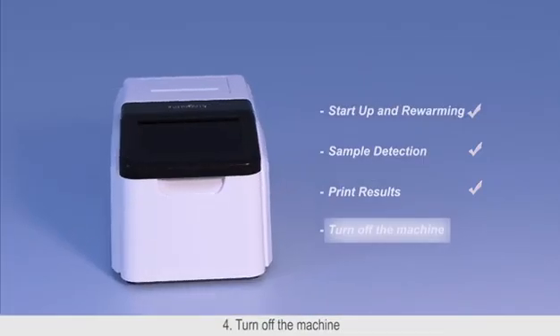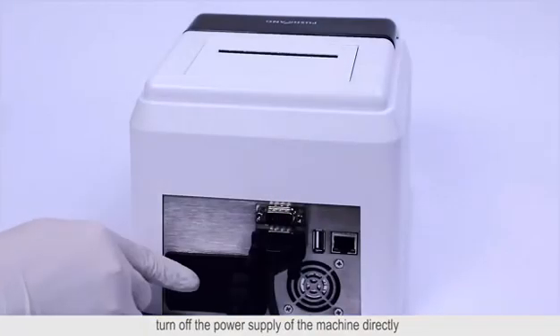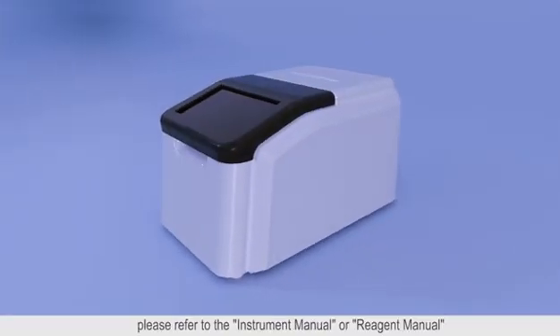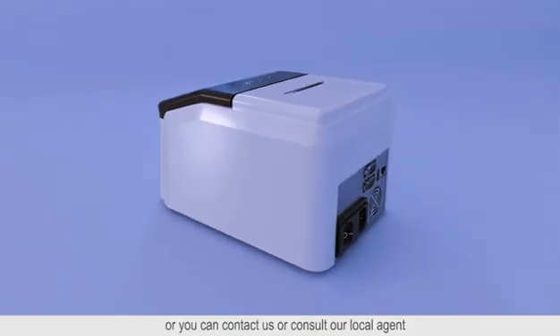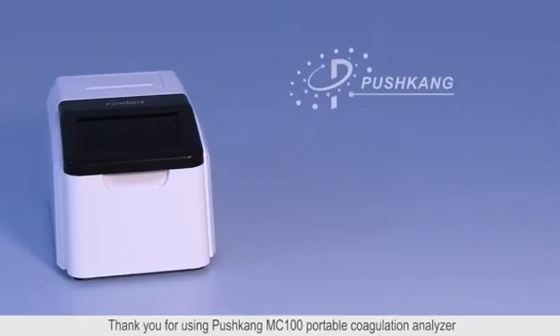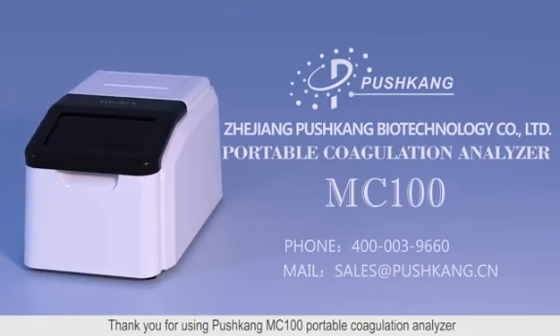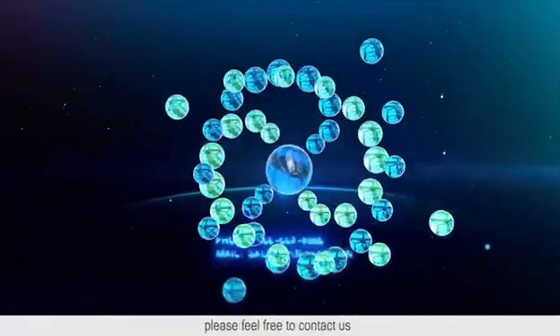Turn off the machine: after all tests are completed on the same day, turn off the power supply of the machine directly. For more details, please refer to the instrument manual or reagent manual, or you can contact us or consult our local agent. Thank you for using the Pushkang MC-100 Portable Coagulation Analyzer. If you encounter any questions during use, please feel free to contact us.